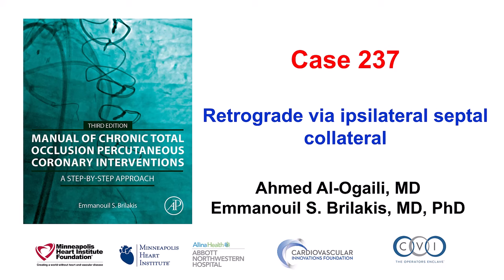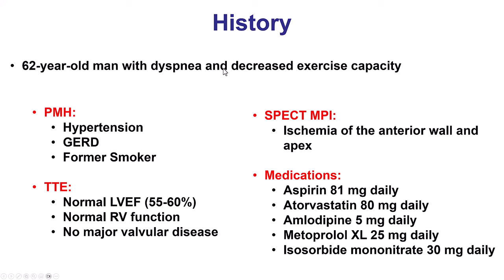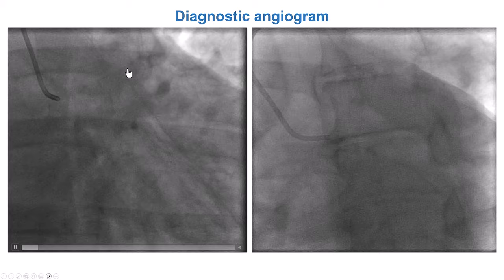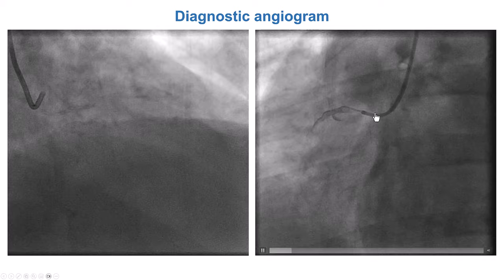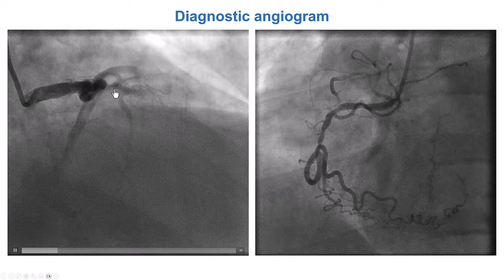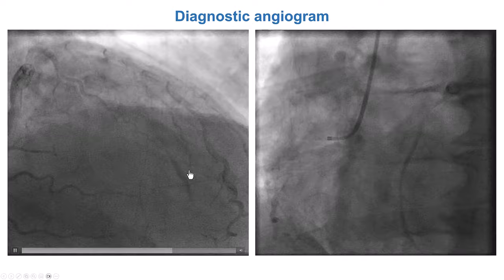This is a case of retrograde crossing of an LAD CTO using an ipsilateral septal collateral. The patient was a gentleman who presented with progressive dyspnea, an anginal equivalent, had normal left ventricular function, ischemia in the anterior wall, and coronary angiography showed heavy calcification and occlusion of the middle LAD with a blunt proximal cap very close to a septal branch. There were collaterals from the right coronary artery, an epicardial collateral coming close to the distal cap, and also some ipsilateral collaterals — a large septal giving a septal-to-septal ipsilateral connection filling the LAD close to the distal cap.